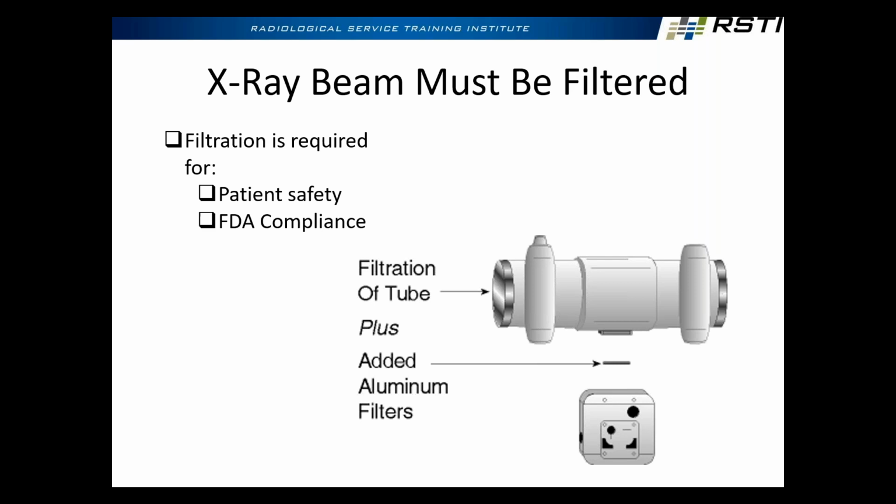Yeah, the iodine at 53. And if we're doing things like intestinal studies, upper GIs, lower GIs, they're going to use barium sulfate. Barium is 56. So way up there, right? Going to really help that stuff stand out. So yeah, if we want to see something that's difficult to see, in a paradoxical way, we make it harder to see and then we make it easier to see. We make it invisible and then we bring back what we want to see by adding some contrast.